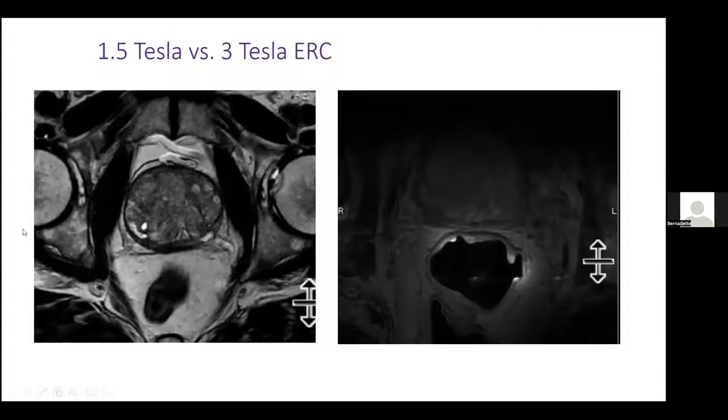Here's just an example of a patient who came to us from an academic university. On the right, we've got this 3 Tesla image with perfluorocarbon in the rectum, endorectal coil, and it's a mess. It's not a good image, and you could do filtering and window level, all these little adjustments to try to make it better. But when you make the front better, you make the back worse, and it's just not a diagnostic image. Then we did the same patient on our little bitty 1.5T and look at the difference.